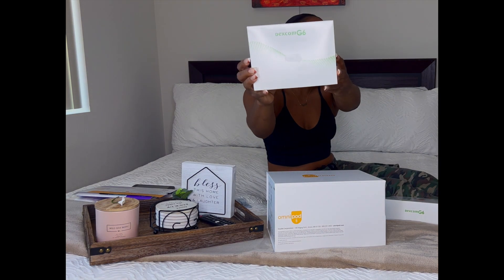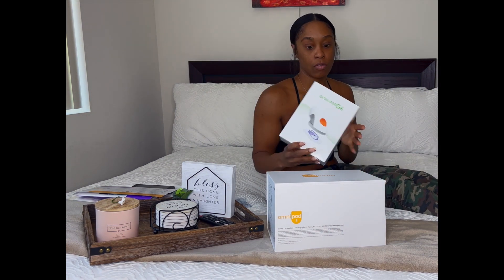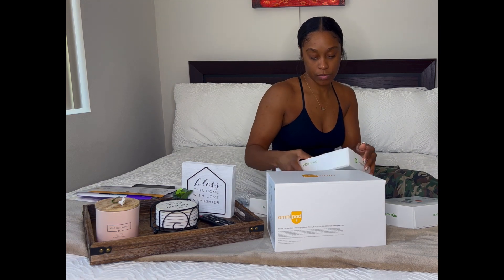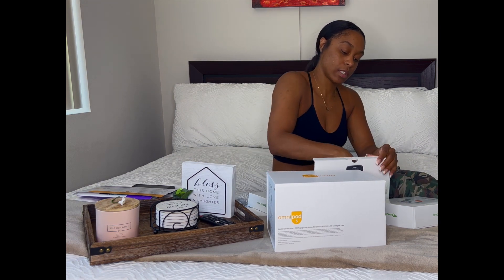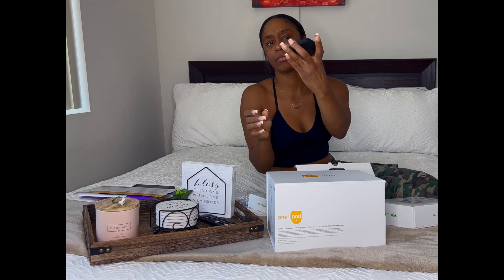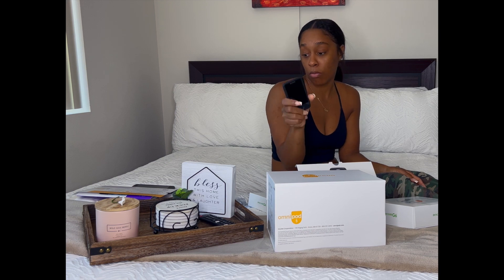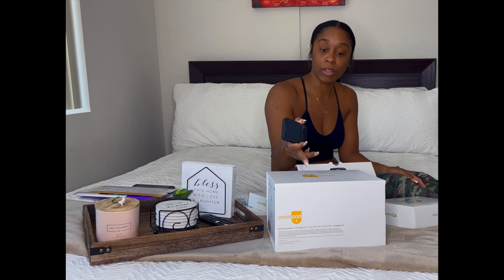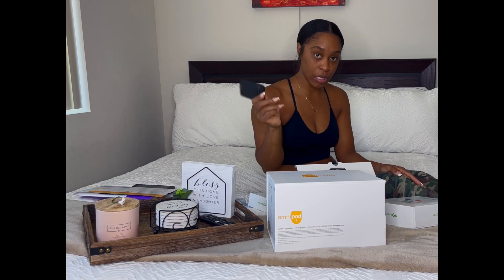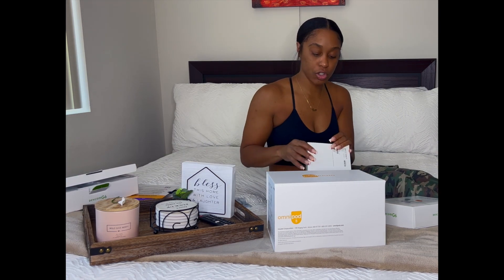This little thing here is the transmitter, and these are the applicators for how you put it on. The receiver is a tiny little phone-like device. When you're using the OmniPod 5, you don't use the receiver — instead, you use the app on your phone so the results come to the OmniPod 5. Make sure you have storage on your phone.